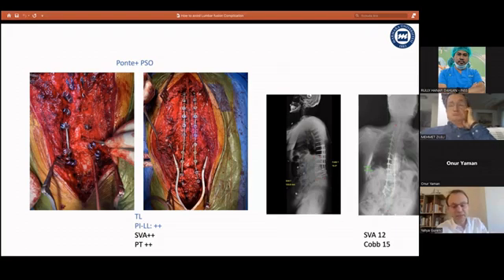we see again pull-out in here, pseudoarthrosis in here. This is our fault because we thought it was enough for the patient, but the kyphosis is very high for these patients, and there is a very big stress in the lower segment, and it isn't enough to use the old screw area for these patients.